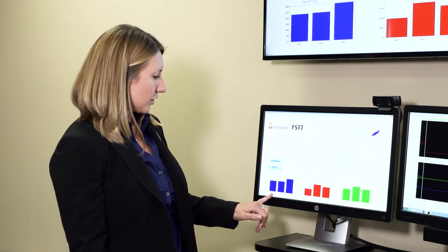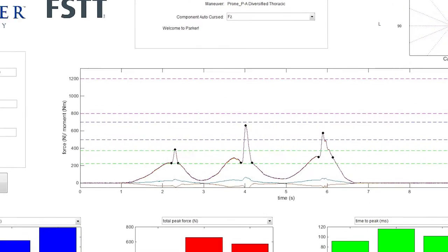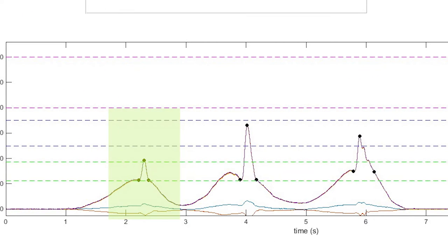In this first section, the blue is your pre-tension force, the red is your overall peak force of your thrust, and then the green is the speed — time to peak, or the speed of your thrust. Looking at the graph, this is where you're not touching the table, then you lean into the patient, find tension and thrust from there. This is more of a thrust on a smaller person or patient who wouldn't need as much force.